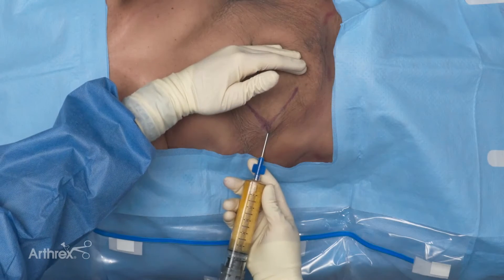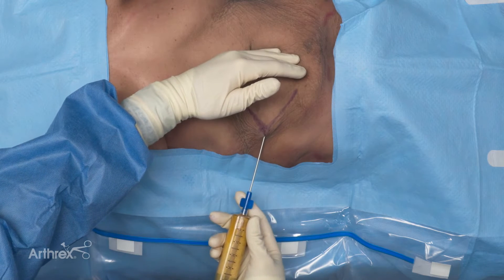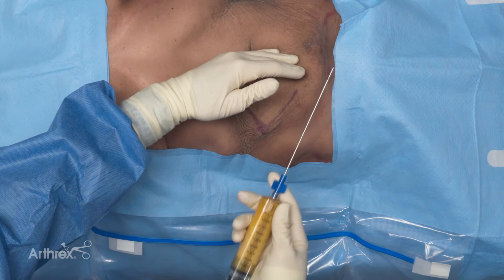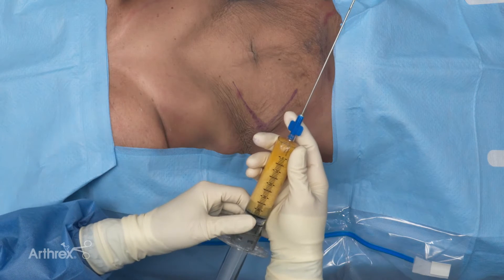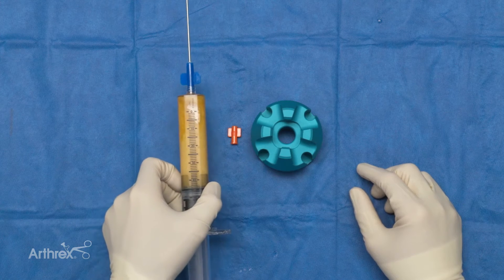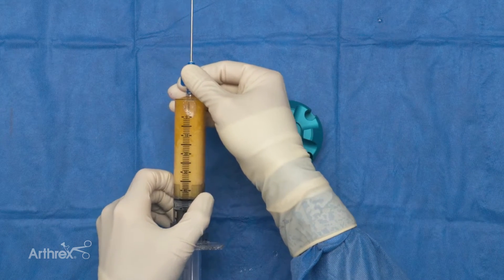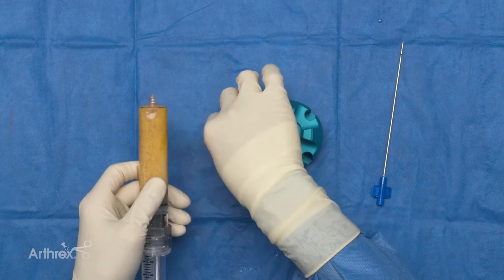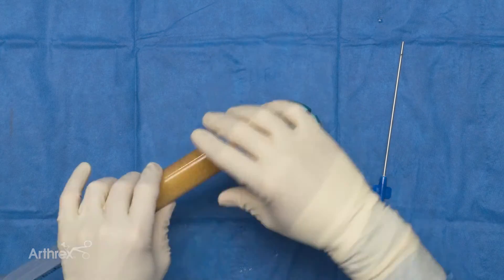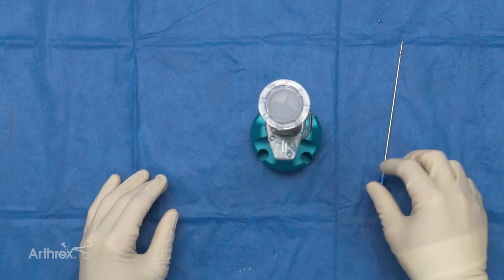Now we've completed our lipo harvest and we're ready to remove the device. Once we've done that, we're ready to begin our final processing. The lipo aspirate has been completed, the adipose restore syringe is full, so now all we're going to do is remove the cannula, place our luer lock on, and place it in the decanting stand to allow the infranatant to come off for five minutes.